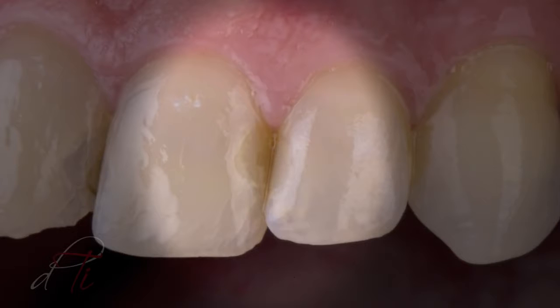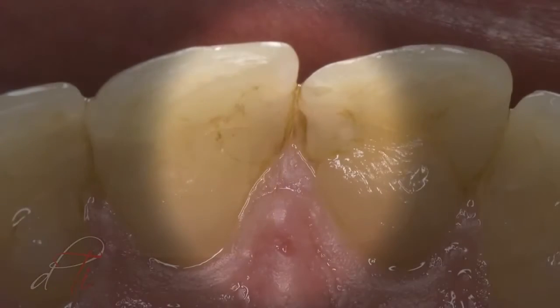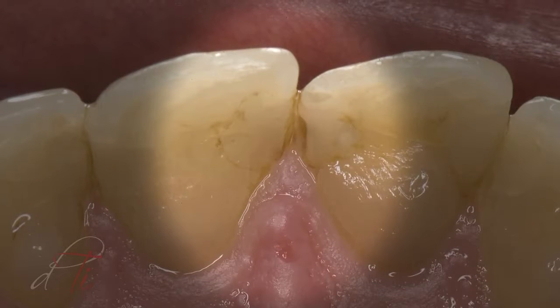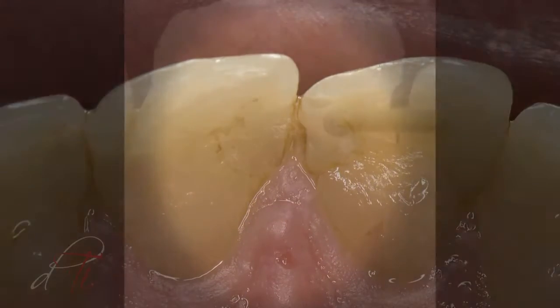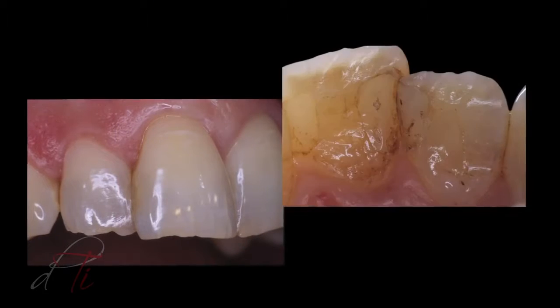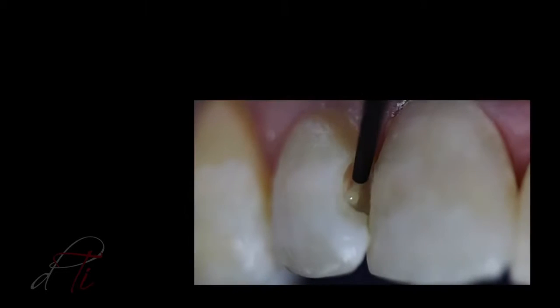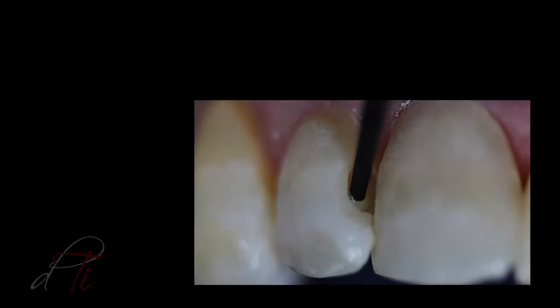Restoring the interproximal zone with composite resin restorations using conventional hybrid composites has always presented challenges. Improper placement of these viscous composite materials can result in gaps, voids, and inefficient marginal seal at the restorative interface. However, by utilizing a modified self-etch technique and a simplified placement of a next-generation flowable, an ideal tooth restorative interface can be achieved.